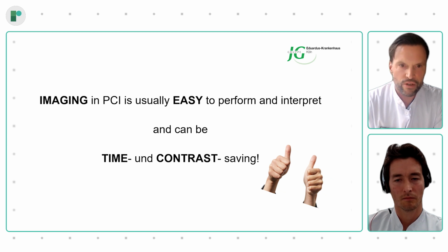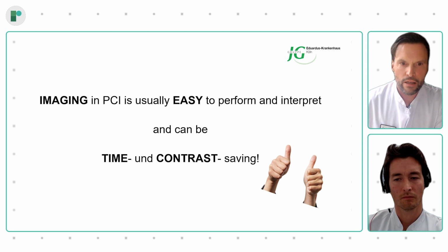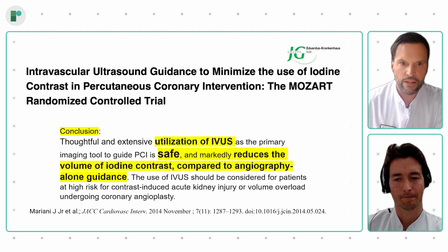You can plan your procedure perfectly, and you don't need additional angulations from the angiogram to estimate the total amount of coronary artery disease in every patient.